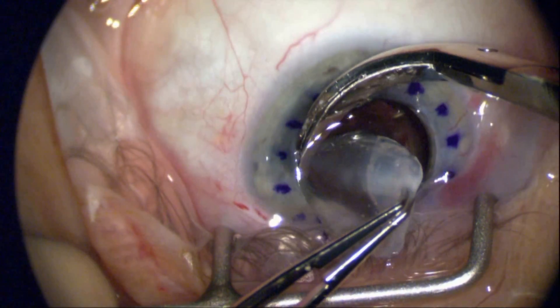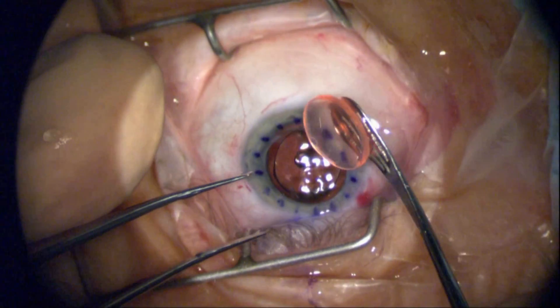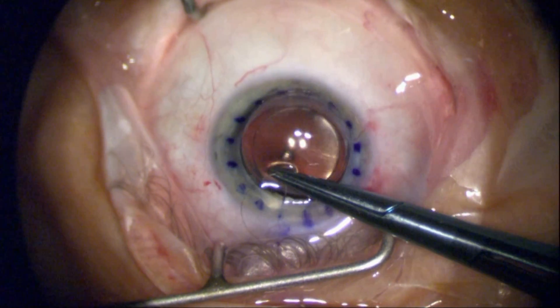A three-piece lens in combination with a smaller capsule rhexis allows it to stay in place better than, say, the Gumby lens, which is much more flexible. We've got the donor tissue, and because of the extent of corneal neovascularization and deep vessels, I'm going to use an interrupted suture pattern.